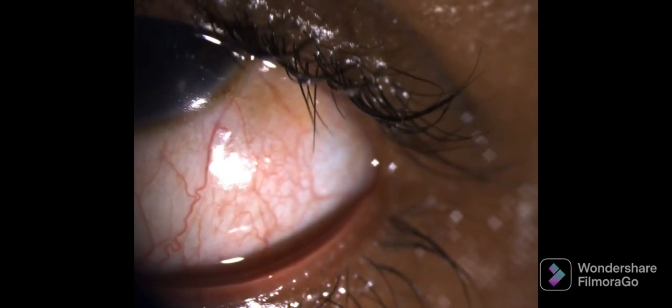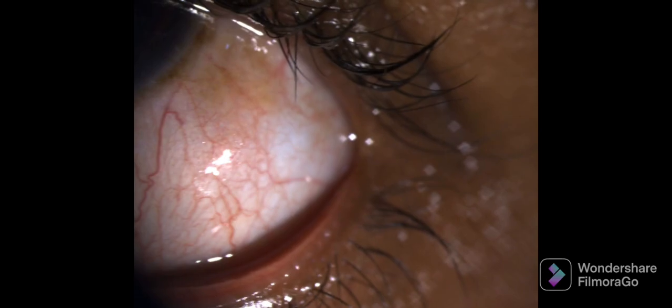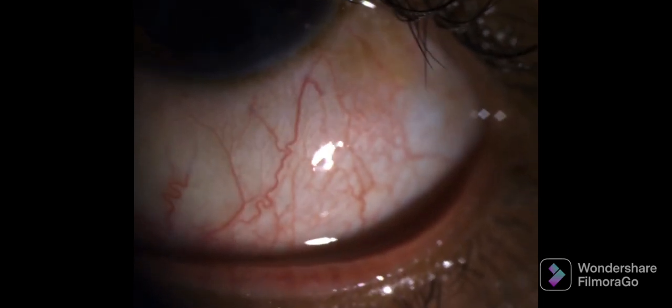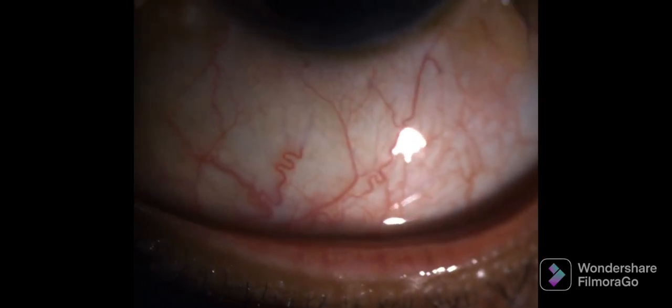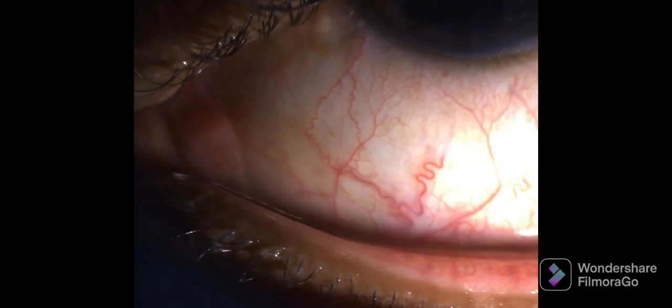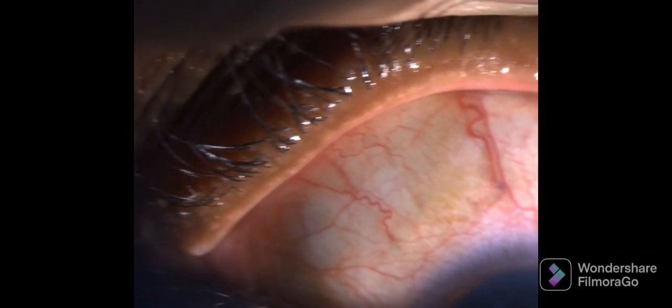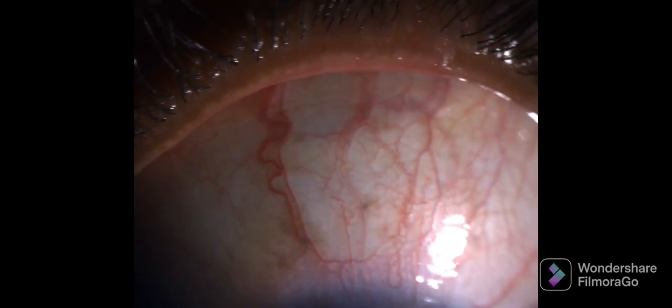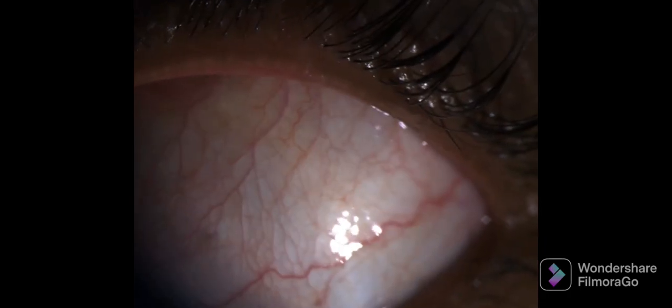The next structure is the bulbar conjunctiva, in which the blood vessels are examined to assess the presence of any chemosis or congestion. Any abnormalities present in the bulbar conjunctiva can be easily appreciated. This is the appearance of normal bulbar conjunctiva, showing normal blood vessels and normal signs of conjunctiva.